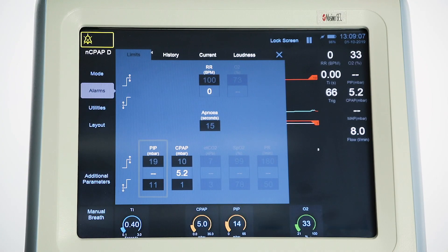Alarms include high and low PIP, high and low CPAP, high RR, and apnea time. The apnea alarm can be turned off.